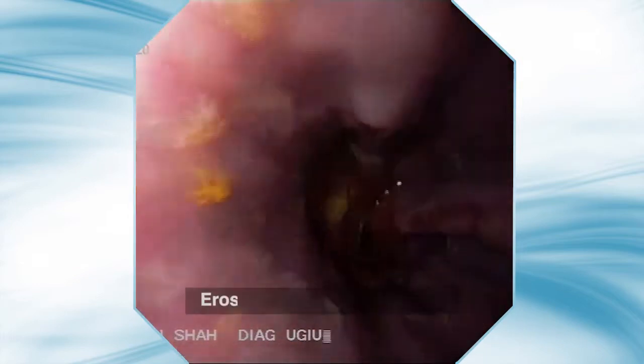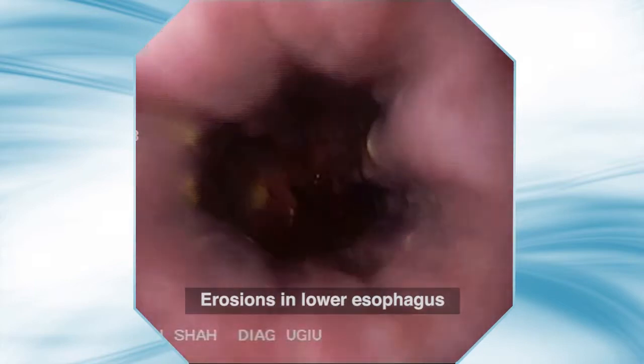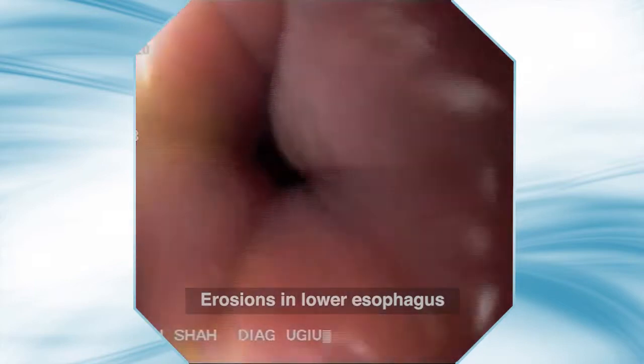Here is an endoscopic view of the esophagus showing erosions in the lower esophagus. These erosions are present above the Z-line.